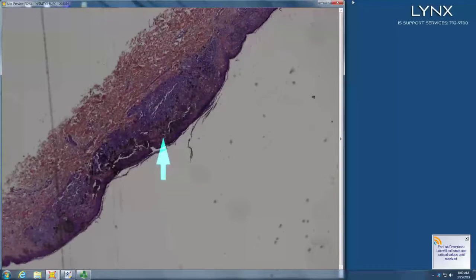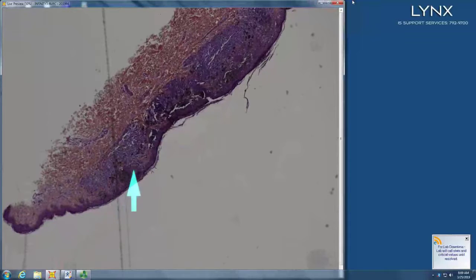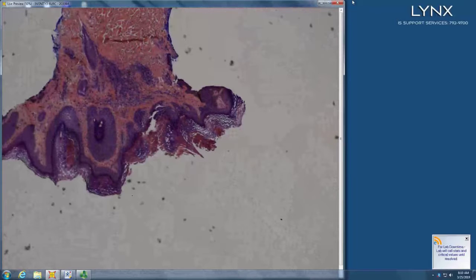This is the same thing as Rachel had in melanoma. Not the same slide, but the same diagnosis. So irregular nesting, band-like lymphoid infiltrate, host response that doesn't like it. Papillomas.